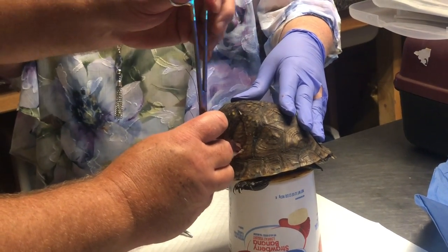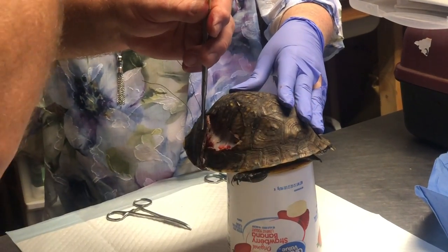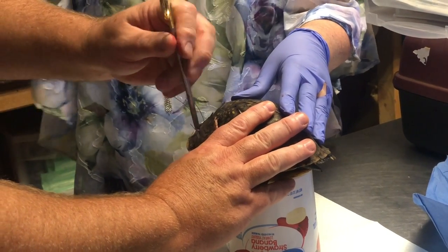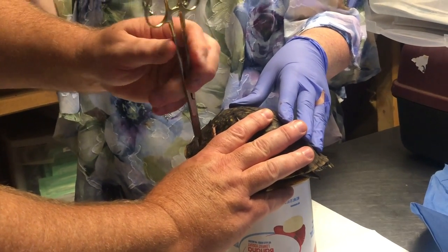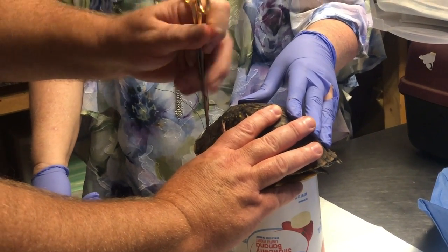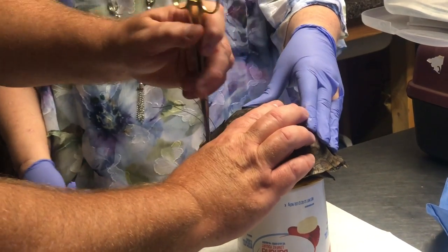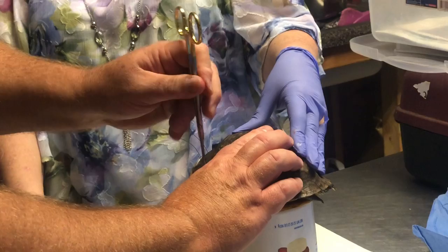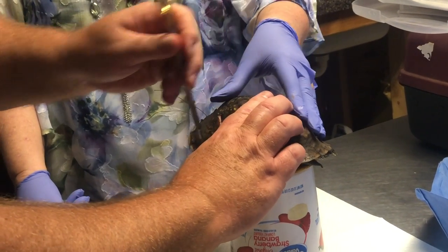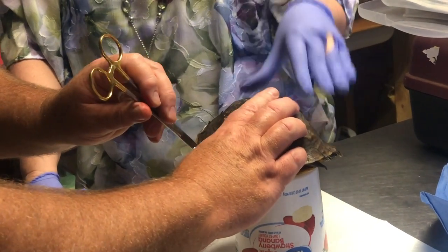Tibia, fibula — think like a wildcat. Ulna, tibia, fibula, ulna. Humerus. Radius and ulna, radius, ulna, humerus. Two here and here — two down, one up. Did you see the x-rays yet? No, I'll show you — it's pretty impressive. I'm out of that loop, no one likes me anymore. No pity party today! Look at that thing just going right back into place — it's gonna pop in just a second. So you don't have to worry about reducing that fracture right there.